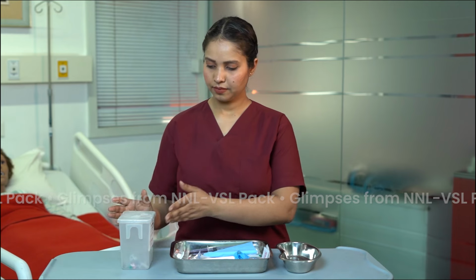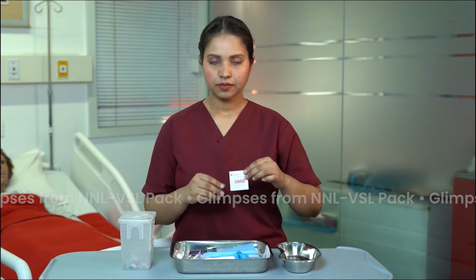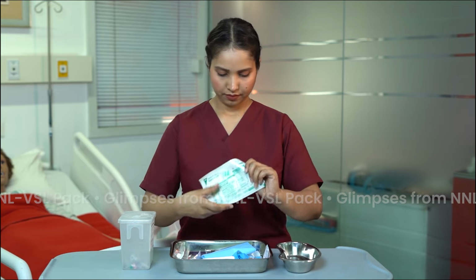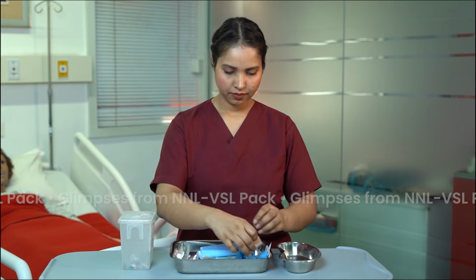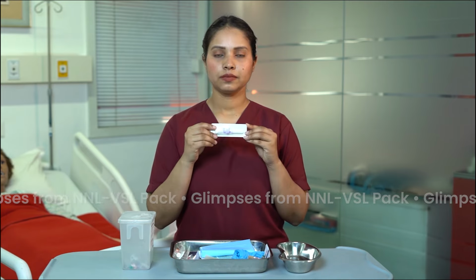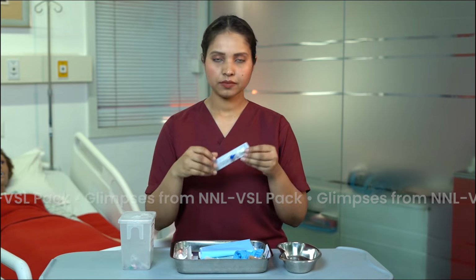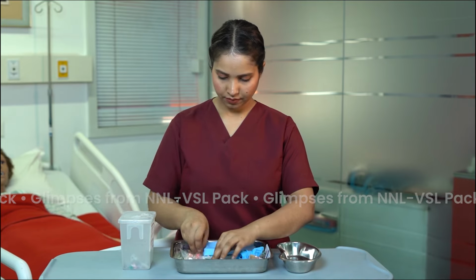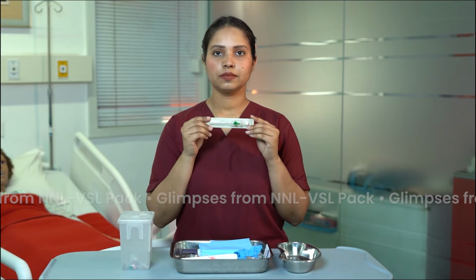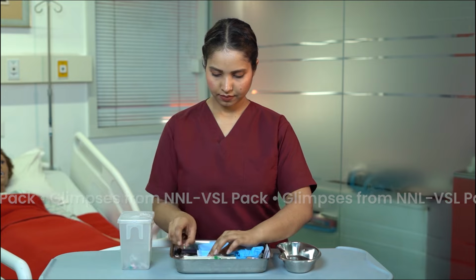A tray containing sharp bin, saline flush, 70% isopropyl alcohol swab, tegaderm, tourniquet, IV cannula of different sizes, 26 purple, 24 yellow, 22 blue, 20 pink, 18 green, 16 grey, 14 orange.